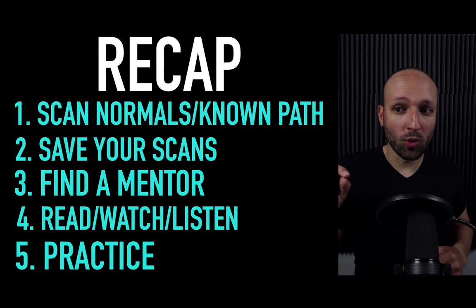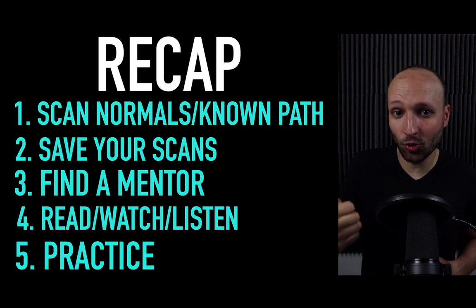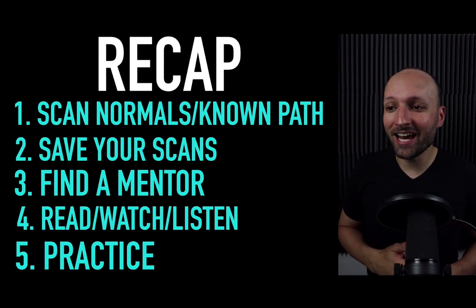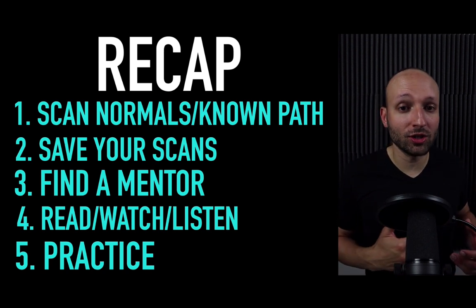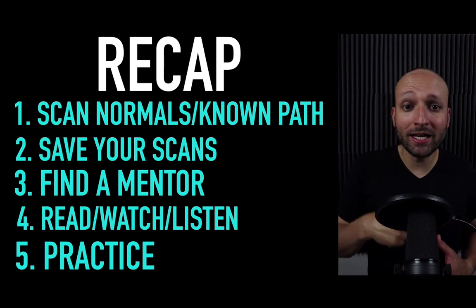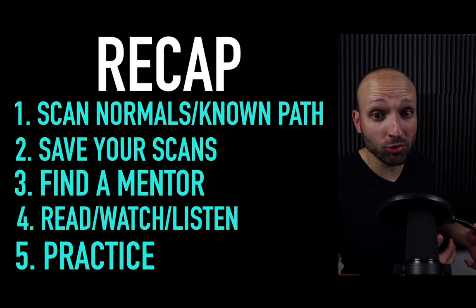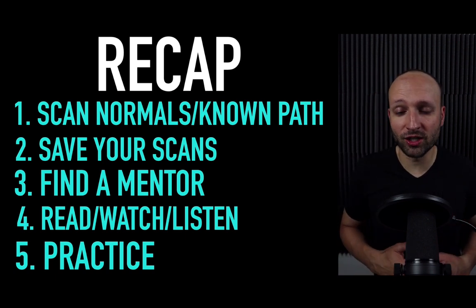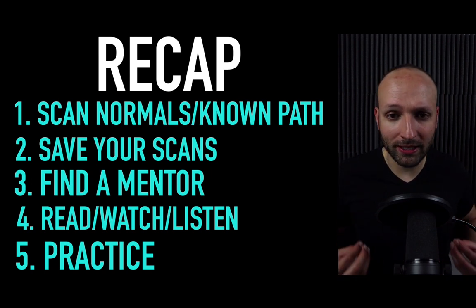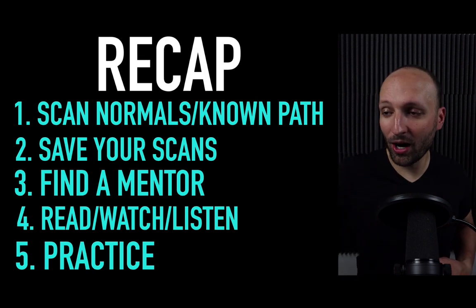To recap, for our first section, number 1, scan known pathology, scan normals, just scan everybody. You got to get your reps in. Number 2, save your scans. This is good for QA, and it's good if you ever want to teach ultrasound. You'll have your own images. Number 3, find a mentor, find somebody in your department, find somebody online, maybe even on Twitter that can help you out if you have questions. Number 4, read, watch, listen. You got to read information, listen to information in order to internalize it. Number 5, don't forget to practice.